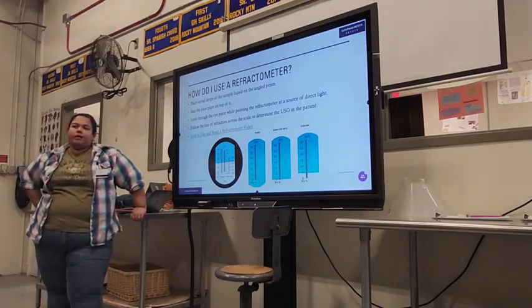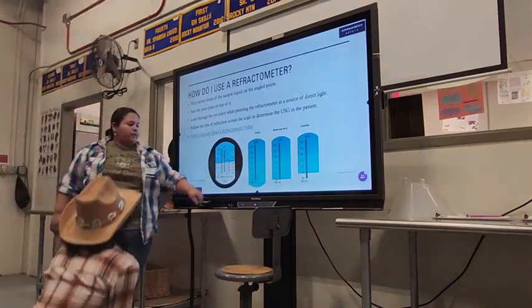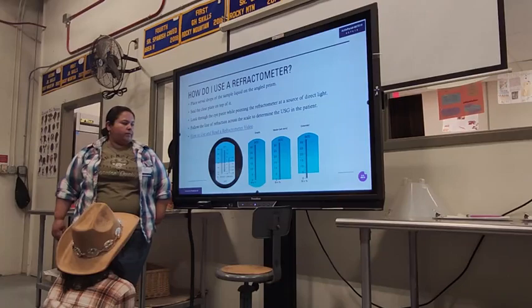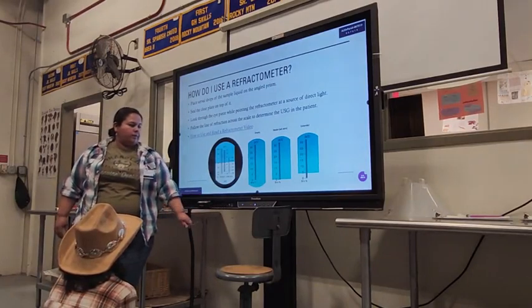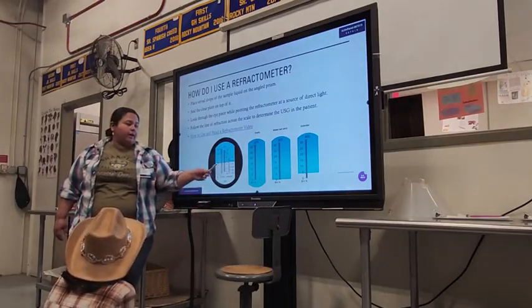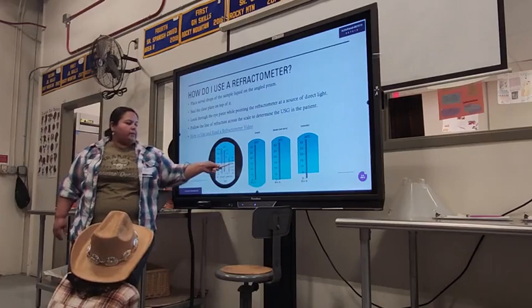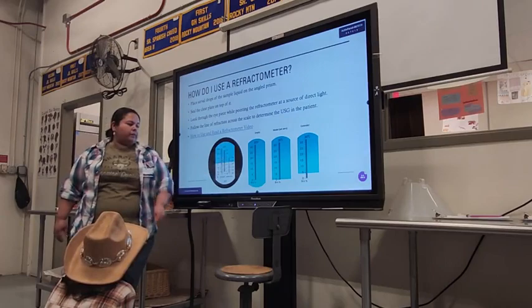You said they're at the values of 2? Mm-hmm. Each space has a value of 2. 1.036. Yeah, exactly right. It's 2, 4, 6. The line is at that 6 mark, right? So the reading would be 1.036.